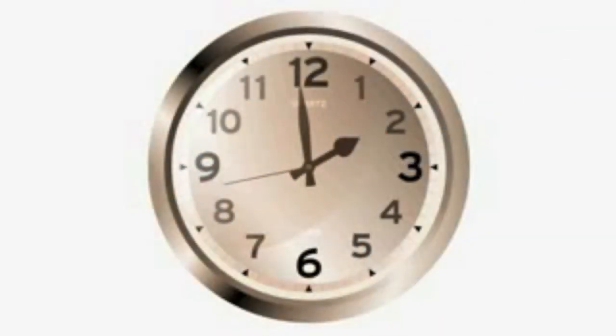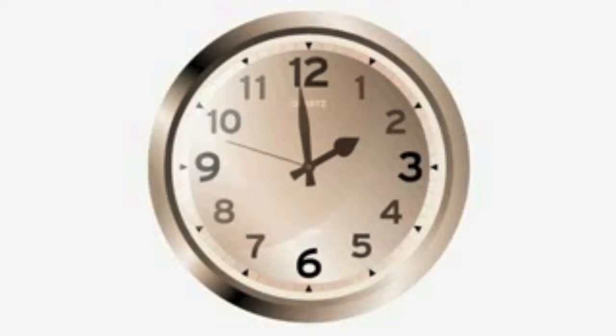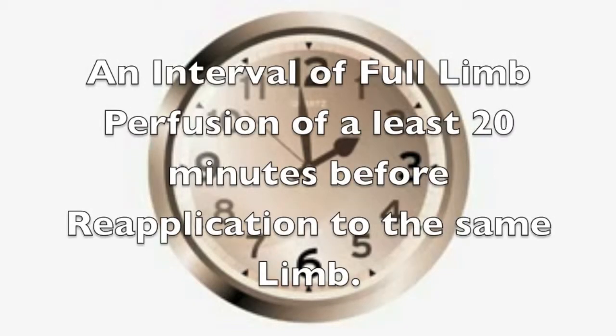The EED's use on a limb should not extend beyond 2 hours. If use of the EED is needed again, an interval of full limb perfusion of at least 20 minutes should be allowed before an EED can be applied again on the limb.